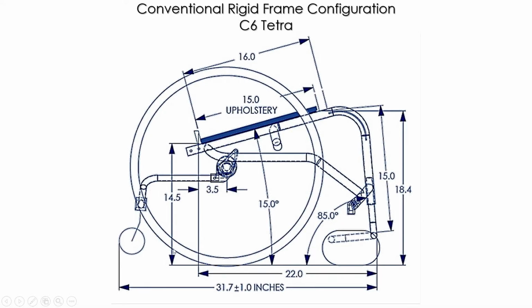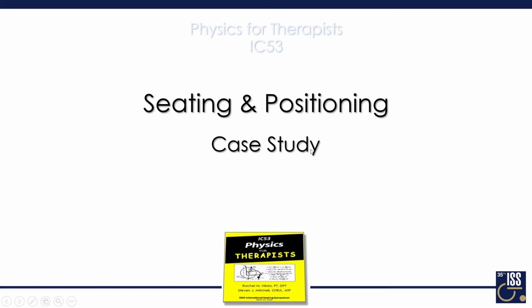So that's his CAD drawing. This was based on an old top-end Terminator made out of chrome moly that he had. He wanted the same rear seat to floor height, and they couldn't give it to him. But he wanted the same seat, so we managed to use the CAD to make that happen.